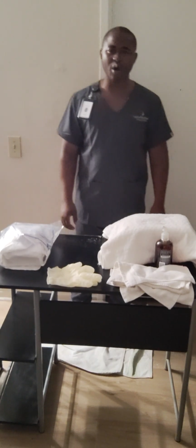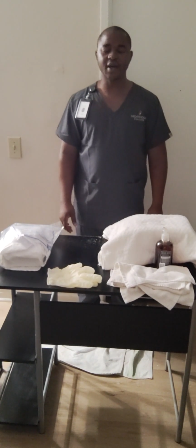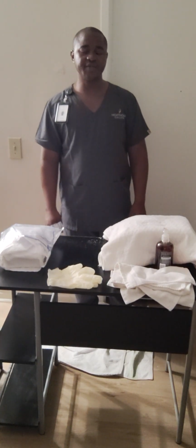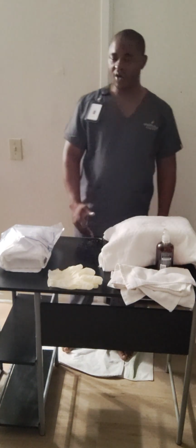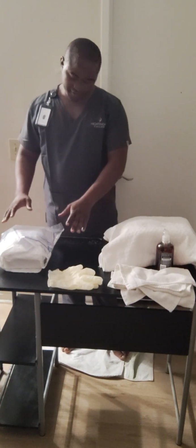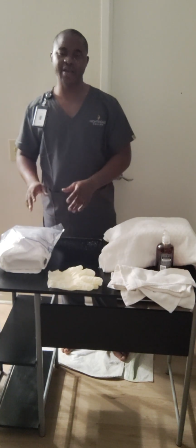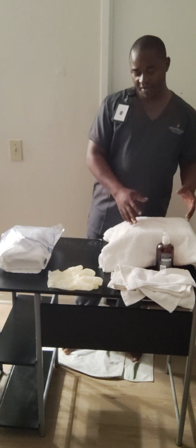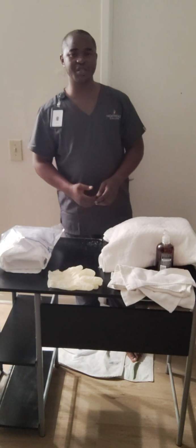Hello, my name is Penda Boma and I'm going to be performing the Foley catheter insertion video on the female patient. For this video I have my washcloths, I have a clean pair of gloves, and I have my Foley catheterization tray, my catheter kit. I have my patient covered right here, the dummy, and I am ready for my procedure.